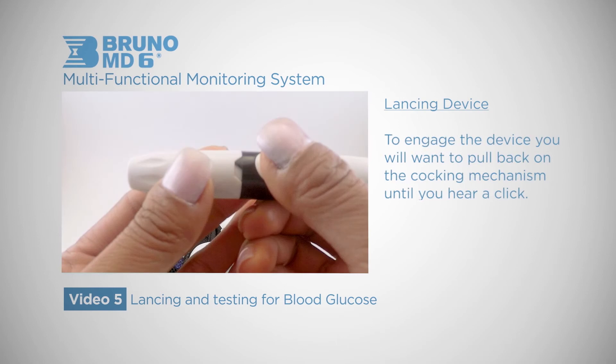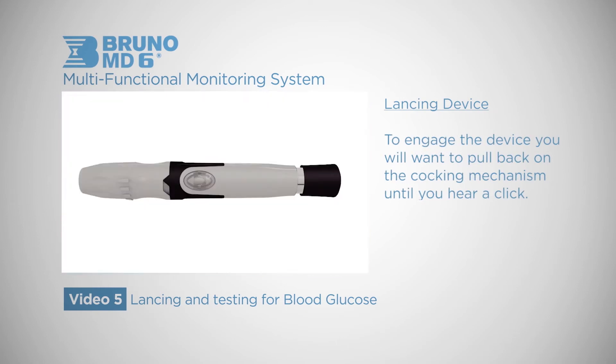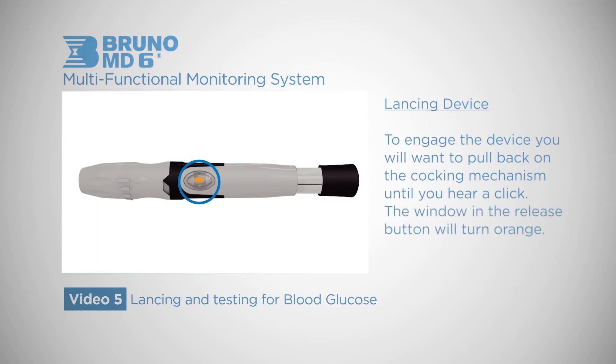To engage the device you will want to pull back on the cocking mechanism until you hear a click. The window in the release button will turn orange. The device is now fully engaged and ready to take a sample.